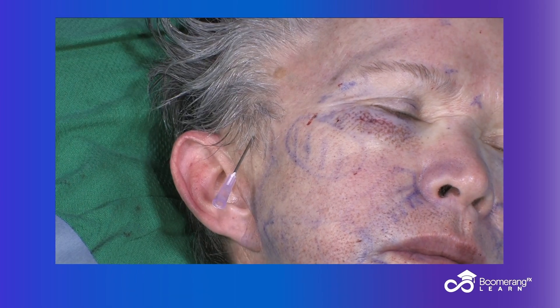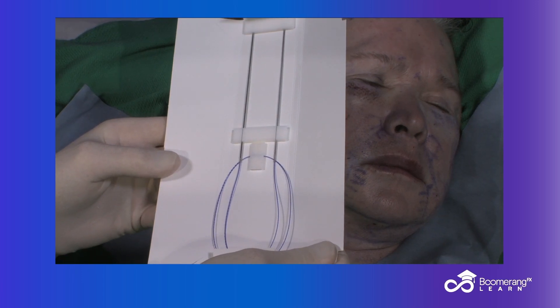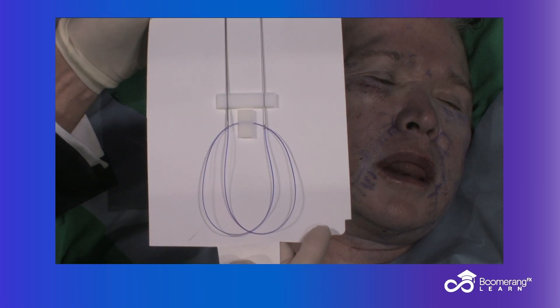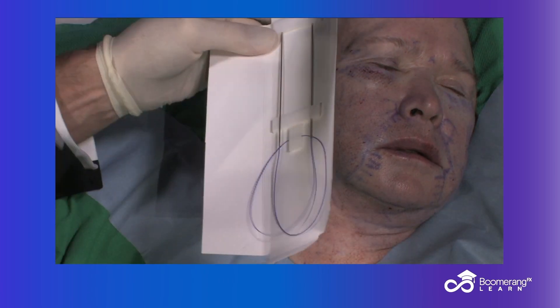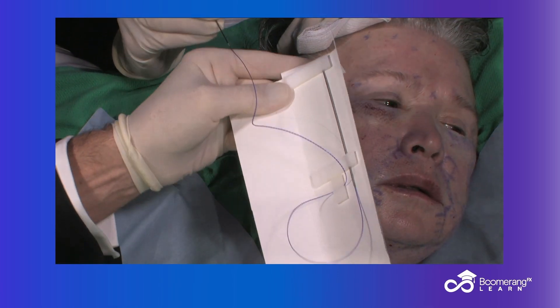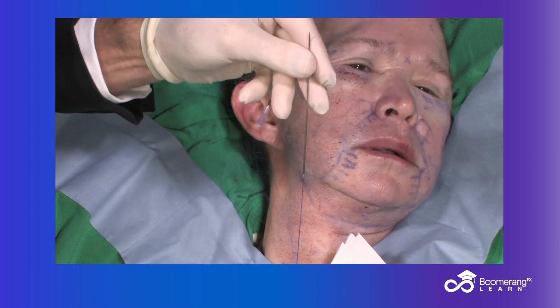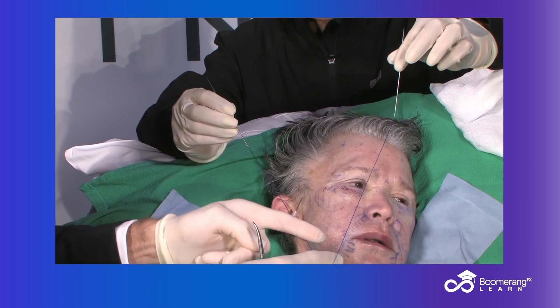I want to grab some tissue. This is our Dew-Arned PDO Molded Max. There is 42 centimeters of length, 21 centimeters on each side. The center — the principle of bidirectional says that the middle of the suture has no barbs, and all the barbs or cogs are pointing back to the center of the suture. I take one limb and pass it up to my assistant. I snap the center of the suture with no cogs right there. I take the second limb, remove the 6-inch Keith needle, and now we have our product — two sutures, 21 centimeters and 21 centimeters.